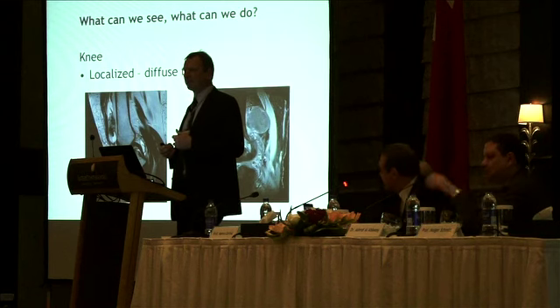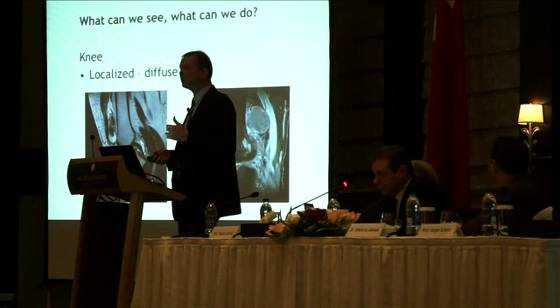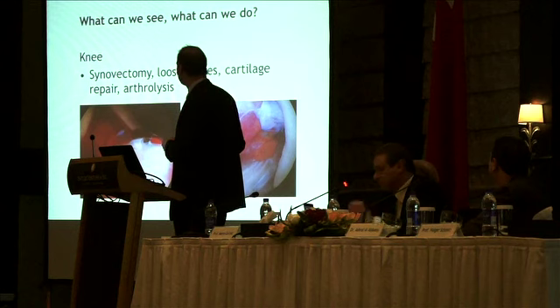Here, the arthroscopic procedures are very limited. And these kind of patients you have to treat by an open approach. What can we do? We can do a synovectomy. You see here a shaver. We can remove the synovial tissue.